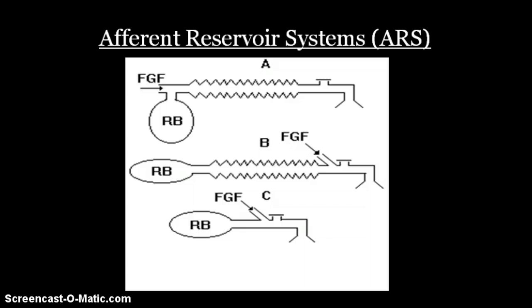These afferent systems work efficiently during spontaneous ventilation if the expiratory valve is separated from the reservoir bag and fresh gas flow inlet by at least one tidal volume of the patient, and apparatus dead space is minimized. Efficiency is lost during controlled ventilation with these systems.